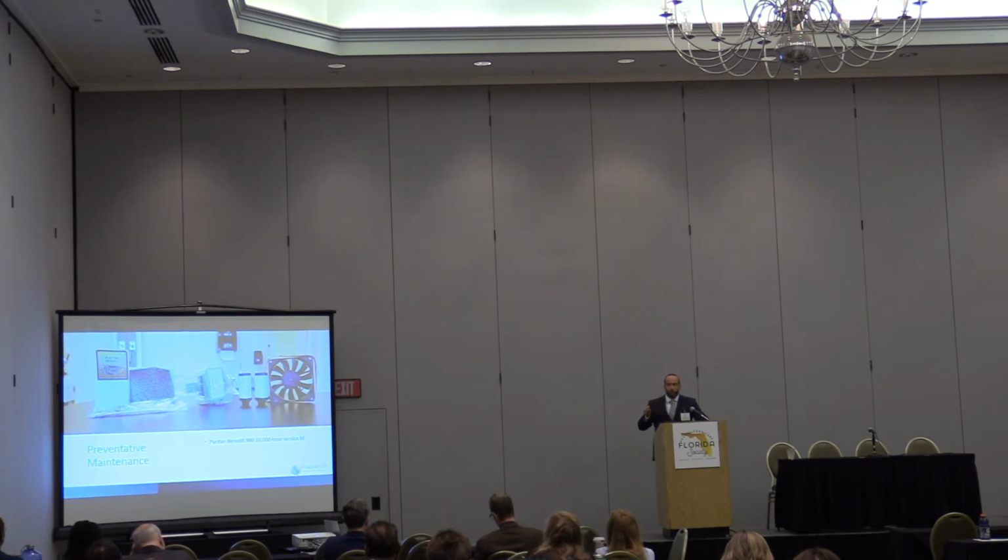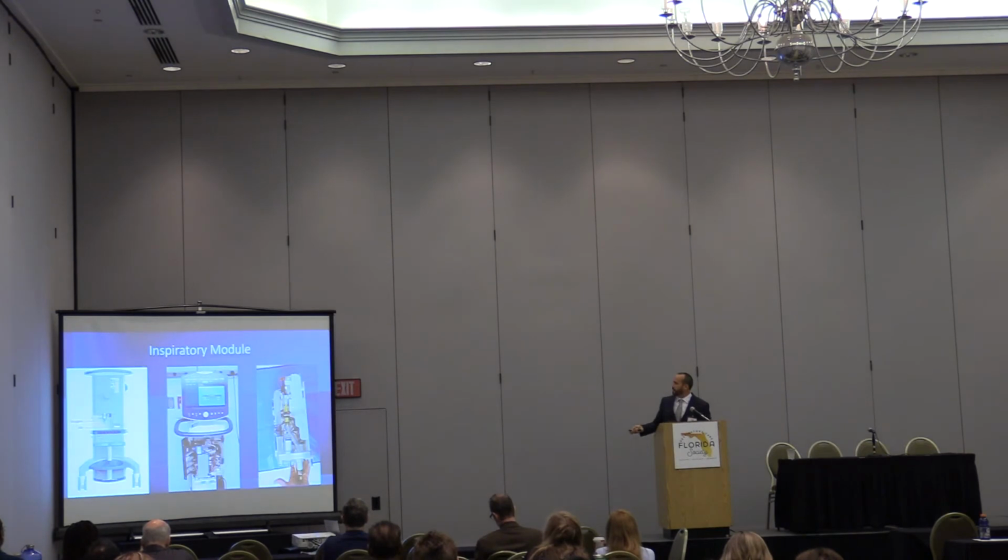But they all really have these filters being changed as part of the servicing process. And why is that? These are the first barrier to getting any contaminants or water into your ventilator. Inside of this vent, it's all mechanical components and electronic components, none of which react very well to foreign contaminants or water or things of that nature.